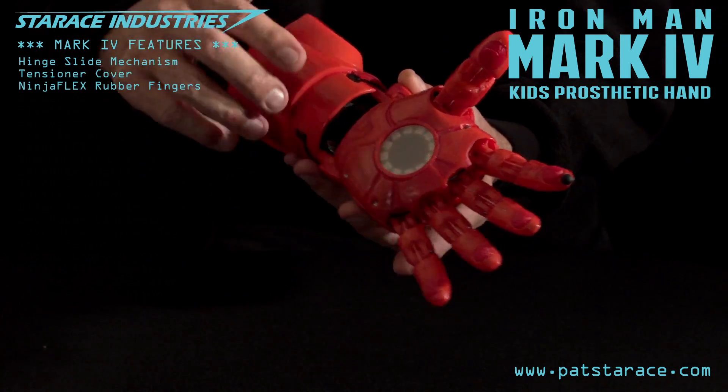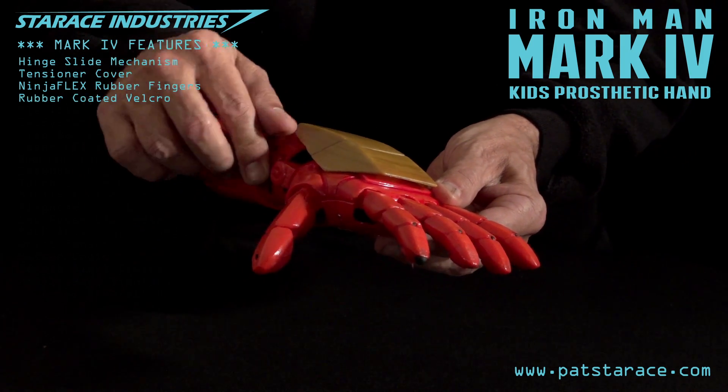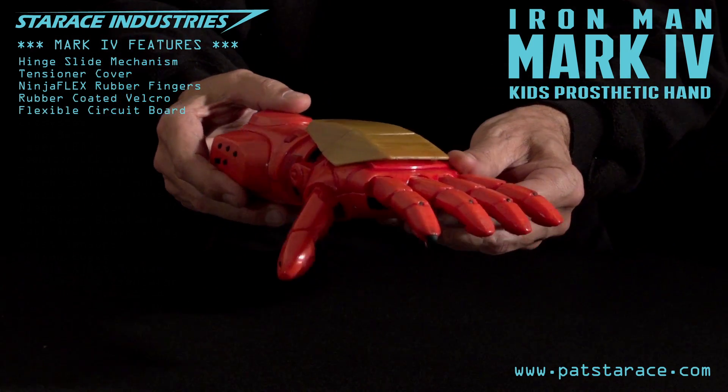Ninjaflex rubber fingertips. And new features including rubber coated velcro straps, flexible printed circuit board, and many new high tech features.